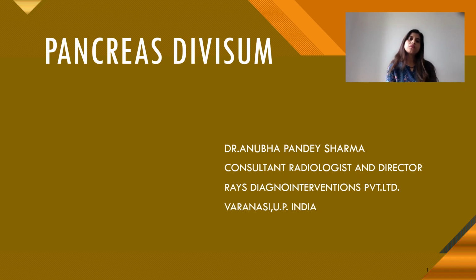I've been practicing radiology for the last 10 years and today I'm going to share a presentation on pancreas divisum with you, with the hope that after watching this video you would be more confident in diagnosing this entity in future.